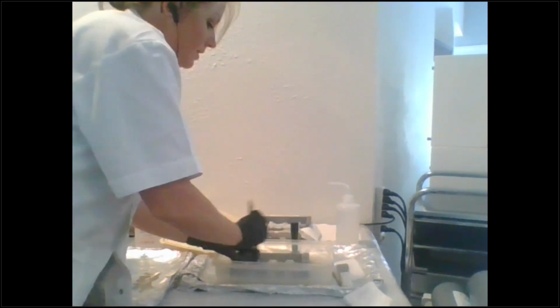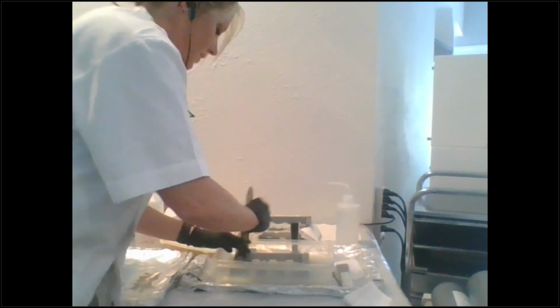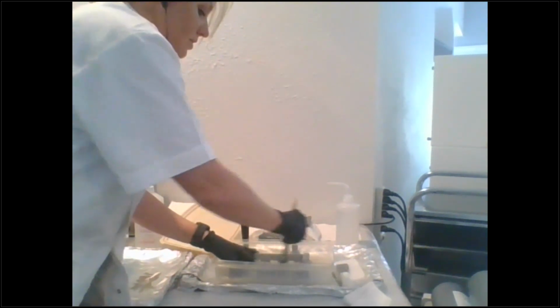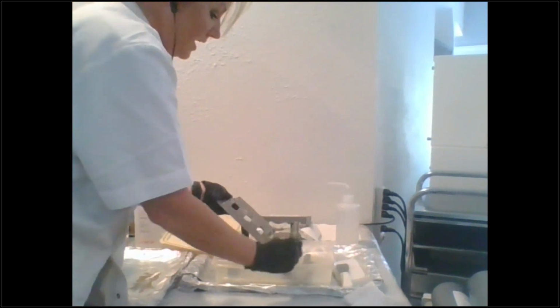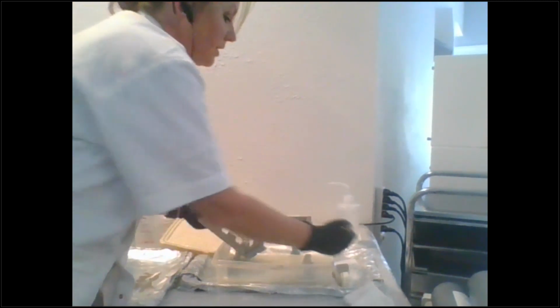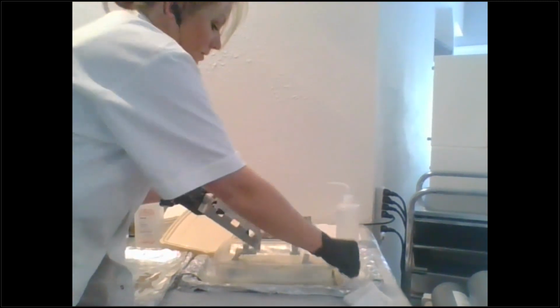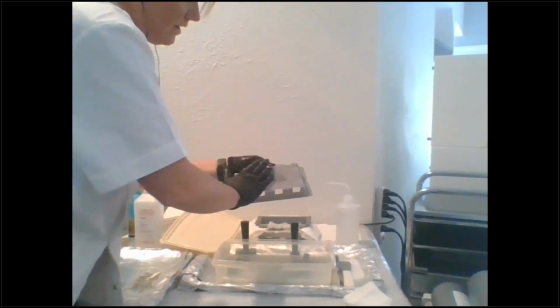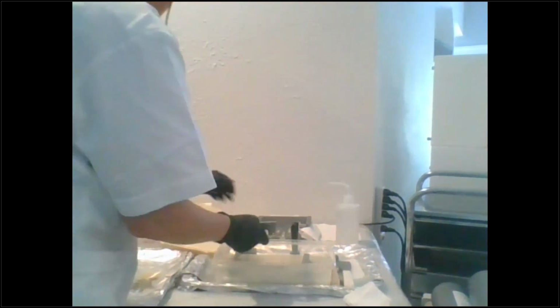Okay, and then the next thing you do is this paintbrush that we sent you with your accessory kit. Everything in your accessory kit actually needs to get used if you want to work efficiently. And you're just going to use this paintbrush, okay? And you can see that I have a couple of more parts here. So you're just going to use this little scraper that we gave you and get those two little pieces off that you missed, and use your glove and see if there's anything left on that build plate, and there's not.